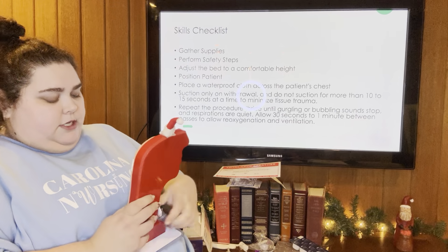Then we're going to gather a suction catheter and, like we talked about, the gloves. This catheter brand has a little container in it that you fill up with water that you suction out. Some brands don't, so you need to bring a container. It just depends what your hospital stocks.